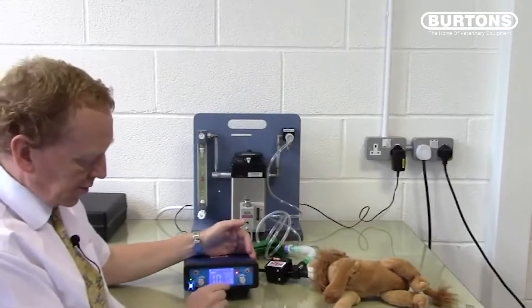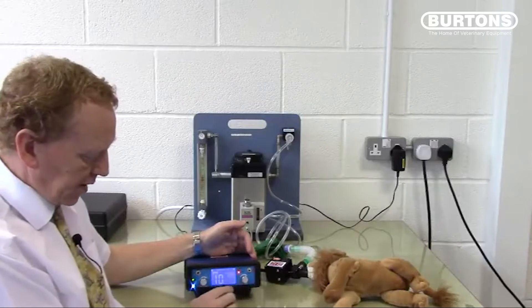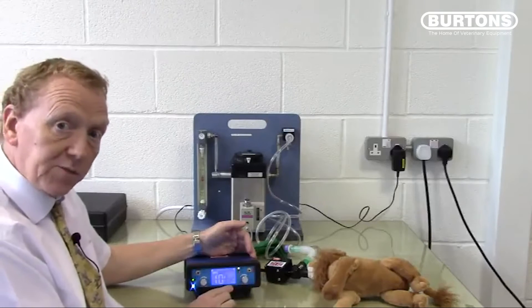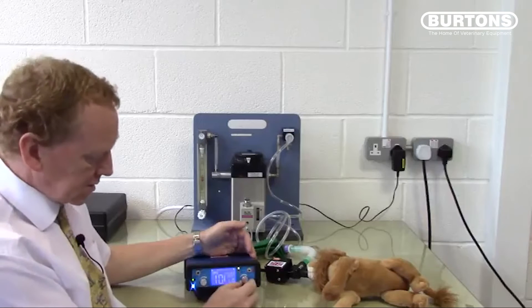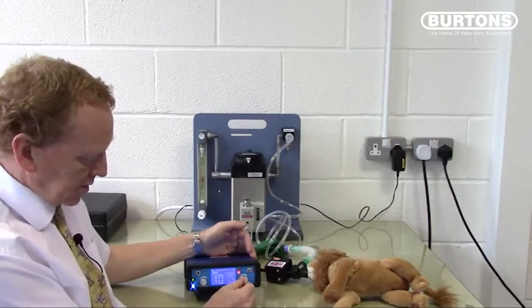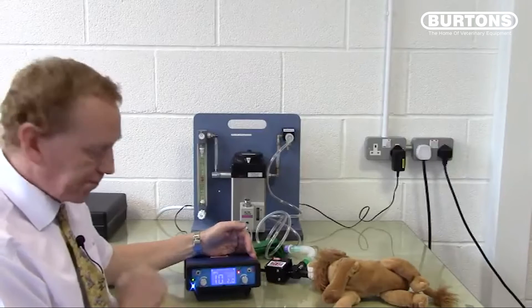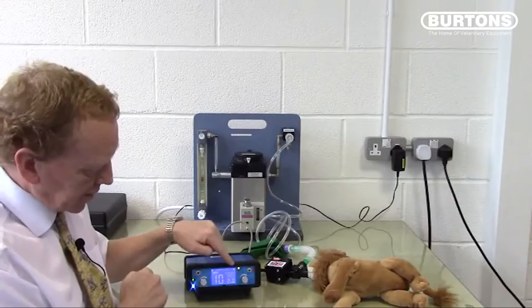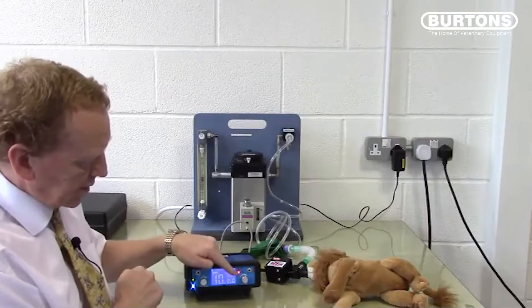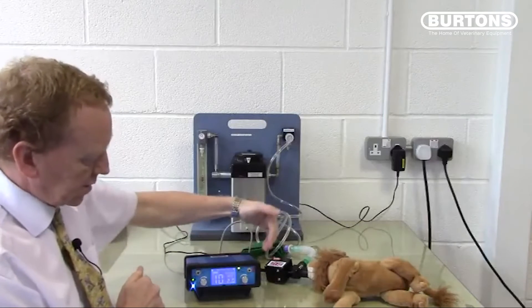The expiratory time is currently set to 1 second. If we turn it up to 2 seconds, it flashes to indicate it's changed but not yet set. If you don't push the button, it will return to 1. Change it to 2 and press the button — it stays at 2. The red indicator light shows when the valve is closed (chest inflates) and when the valve is open (animal expires).